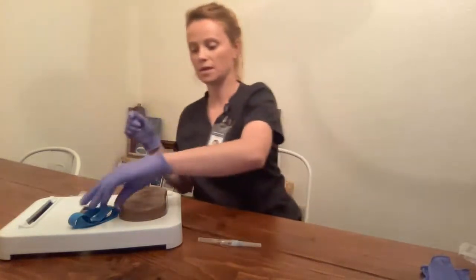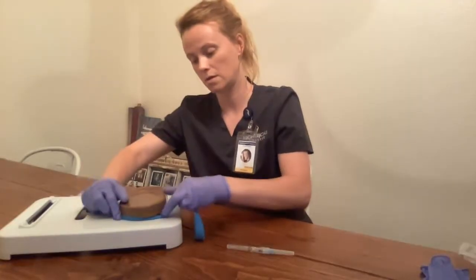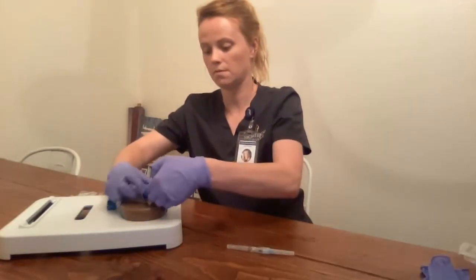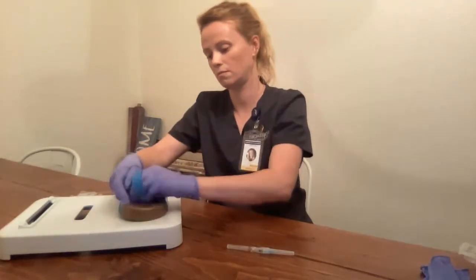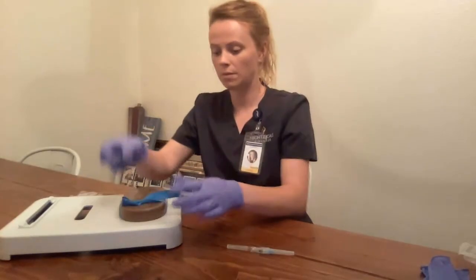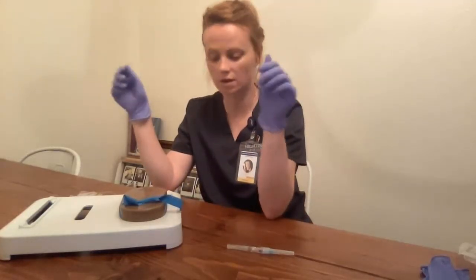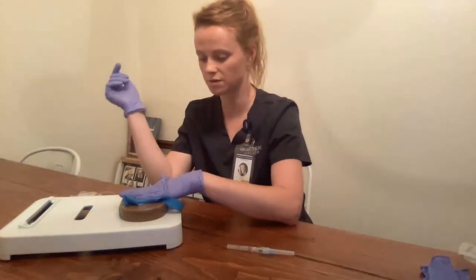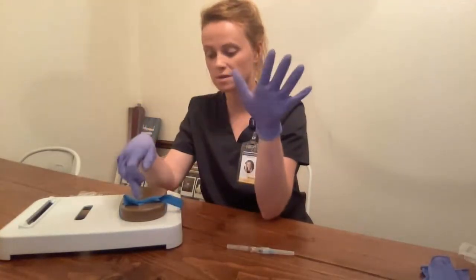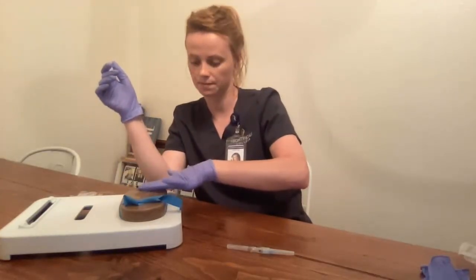I'm going to come to my site here and apply the tourniquet. When applying the tourniquet, I want to make sure it is 4-6 inches above the insertion site. I'm using my fingers here — it is at least 4 inches above the insertion site. I also want to ensure that it's not too tight and that I can feel a distal pulse. I can.